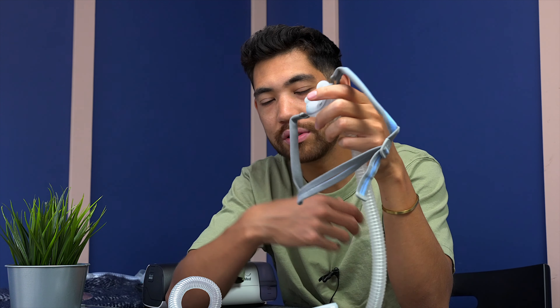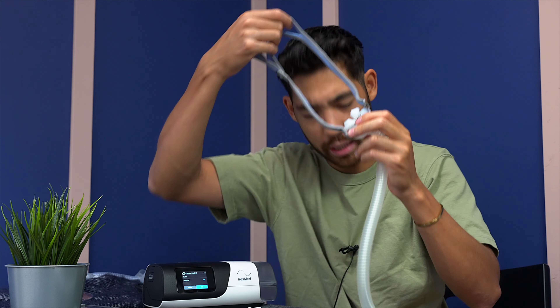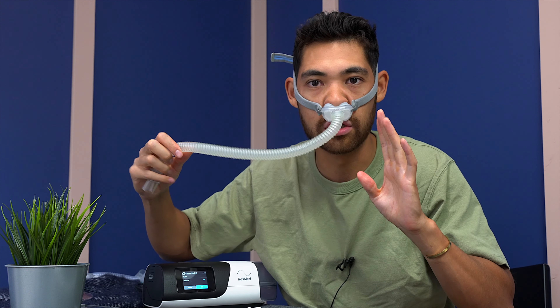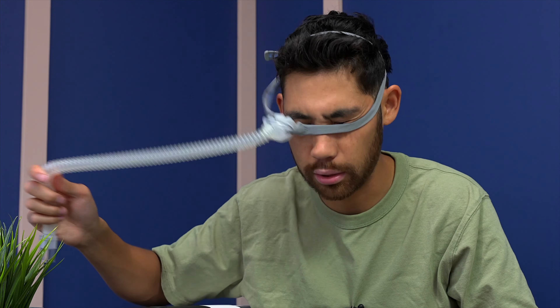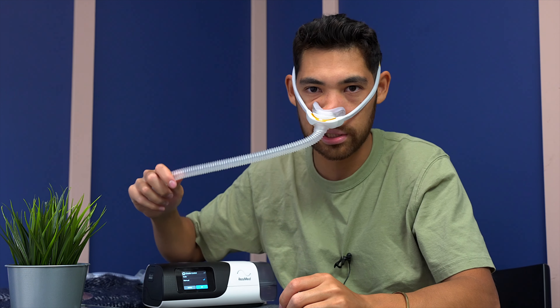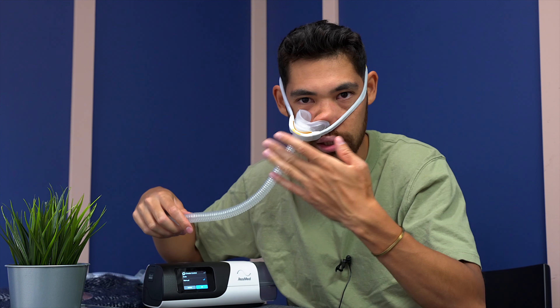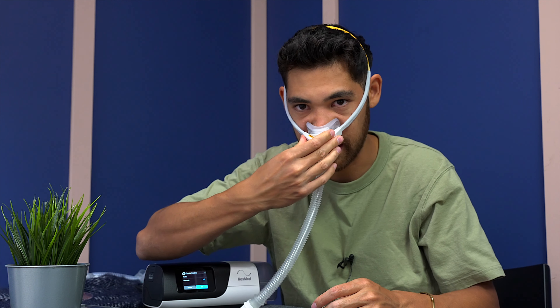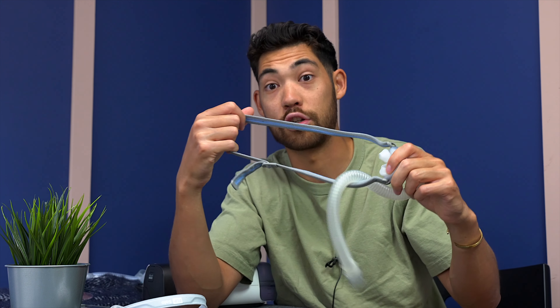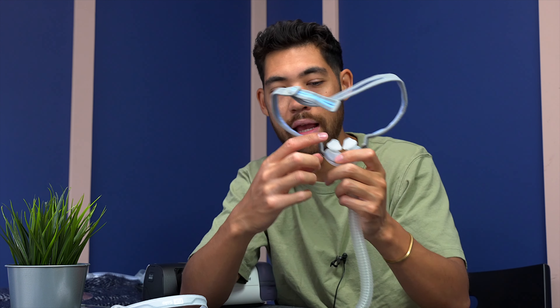In terms of leak rate, as a dynamic sleeper the Solo is better, and as a static sleeper the ResMed is better. The reason is because the ResMed has a stretchy headgear — with very little tension you can pull it so the strap stretches and it moves out of place, and it doesn't spring back. You can see it come off the nose. Whereas because the Solo locks in with the cable system, if you tug it, it stays more on the nose and you can just push it back. So for pillow rolls, rolling around, and side sleeping, the Solo is better because it's more stable, whereas the ResMed really just stretches off. But if you're laying on your back sleeping, the ResMed is lighter weight, a little more comfortable, and the pillows provide a better seal.